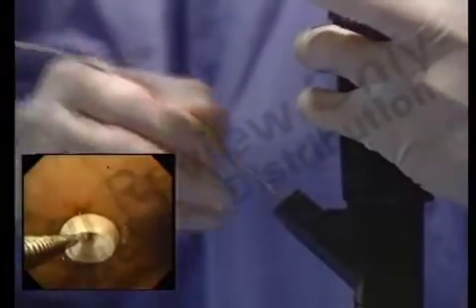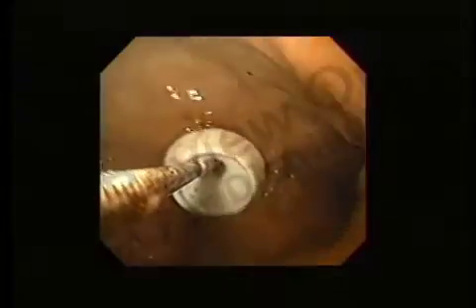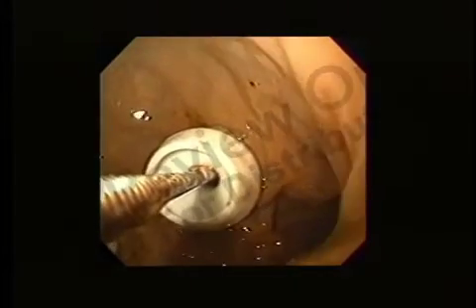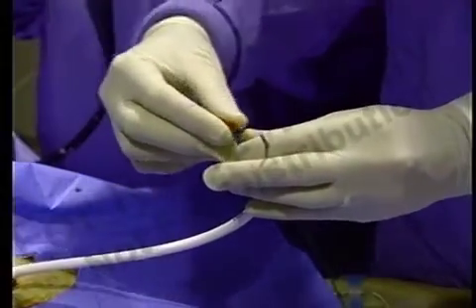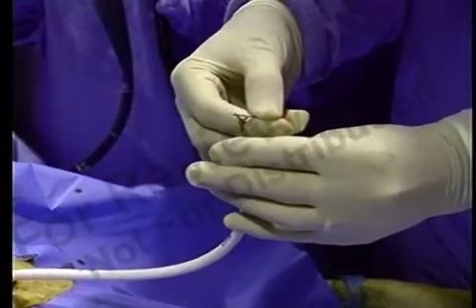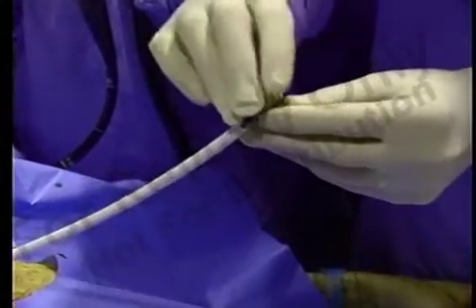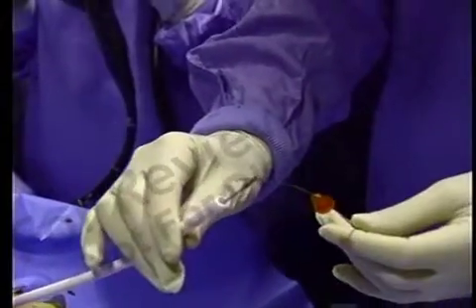Place biopsy or alligator forceps through the gastroscope and push forceps through the G-tube from the stomach until seen exiting the G-tube. Place the air plug over the wire guide and grasp the end of the wire guide with the forceps. Pull the wire guide and forceps back into the tube and place the air plug securely in the end of the G-tube to minimize air leakage.